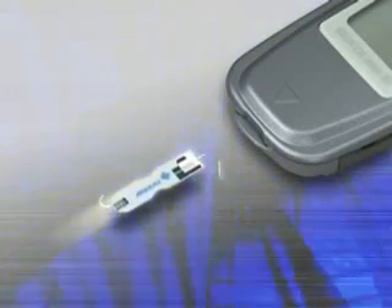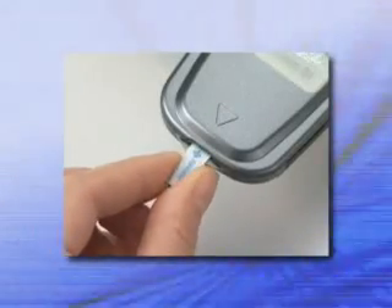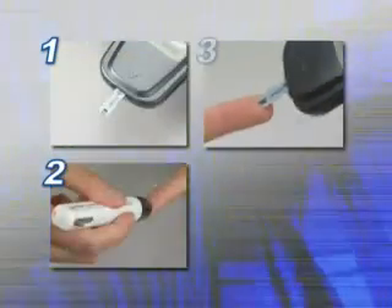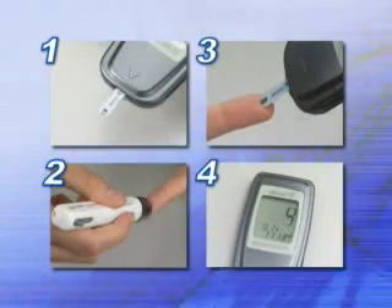Glucocard 01 is simple and easy to use. Simply insert a test strip, apply just 0.3 microliters of blood, and blood glucose is measured in only 7 seconds.